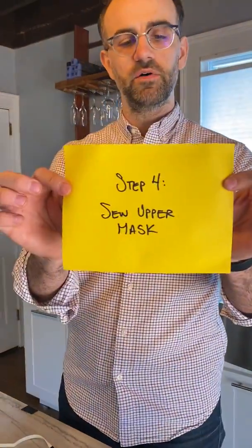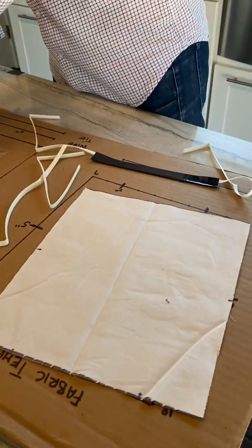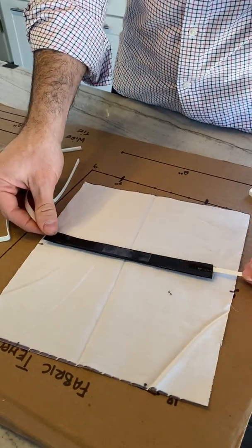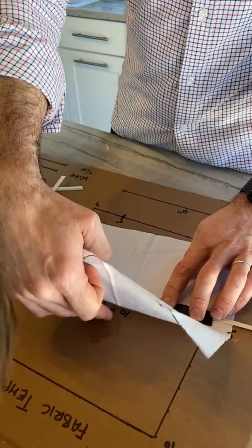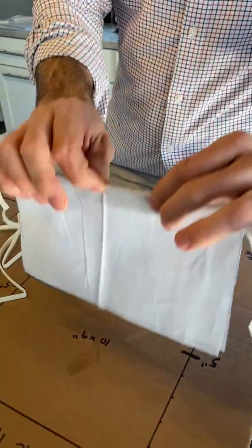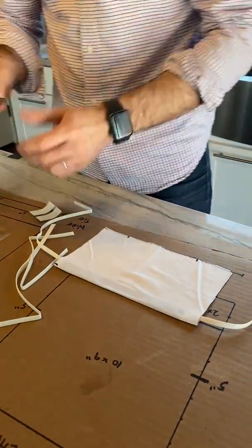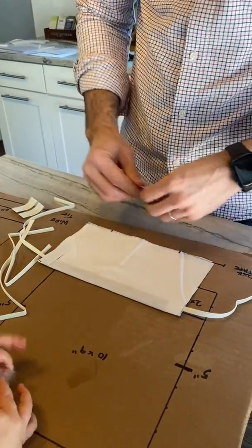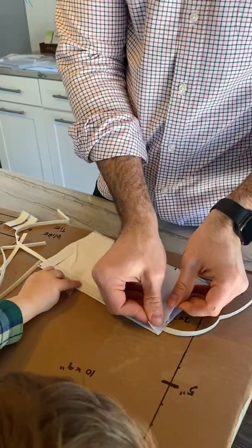Step four: sew upper mask. Take a little piece of two-sided tape if you want — I've done it without the two-sided tape and it works just fine, it's just a little harder. Put the wire side in the very middle and fold this over. You have to be careful to keep the wire at the top so your needle doesn't hit it. Then take two pieces of velcro — I like keeping the cloth side of the velcro on the cloth; the plastic side of the velcro we'll put on the plastic face shield.